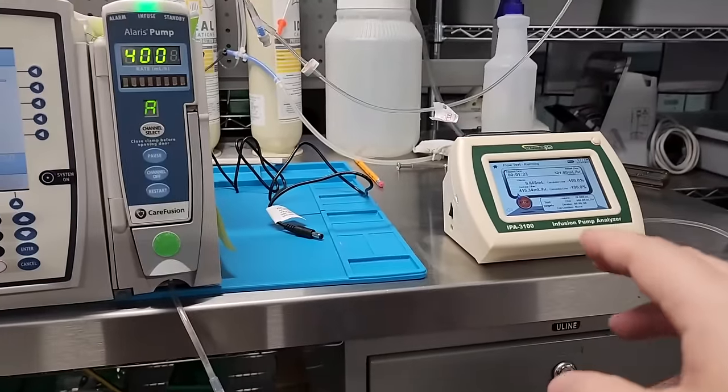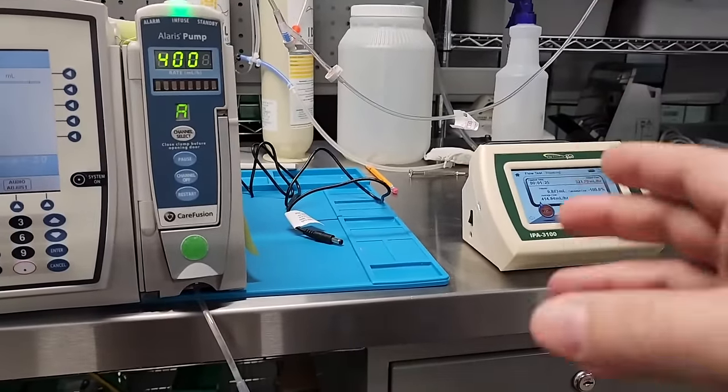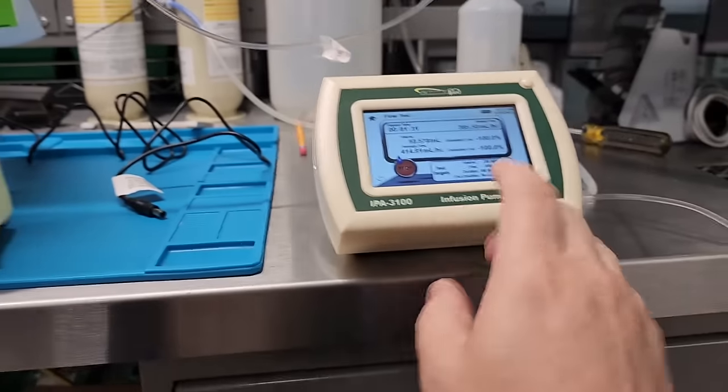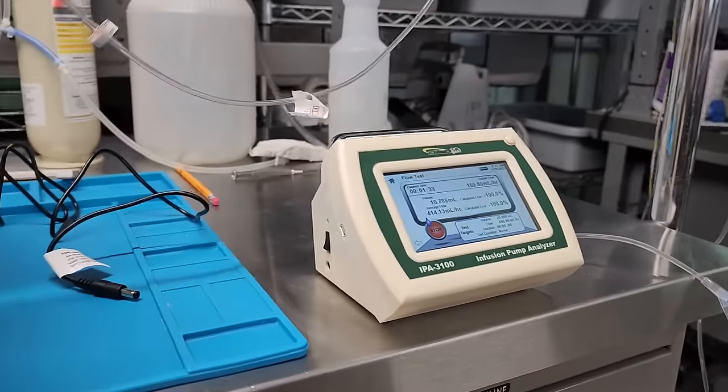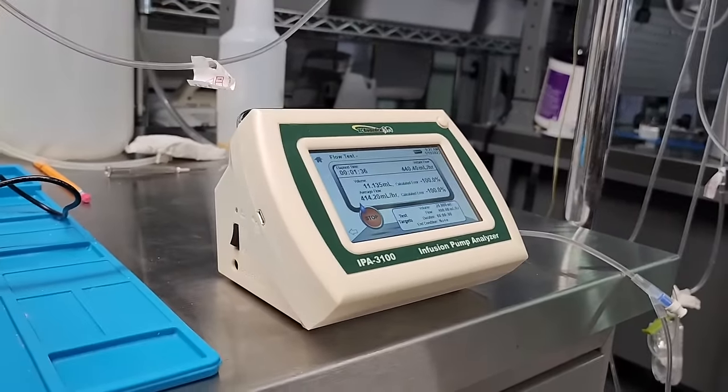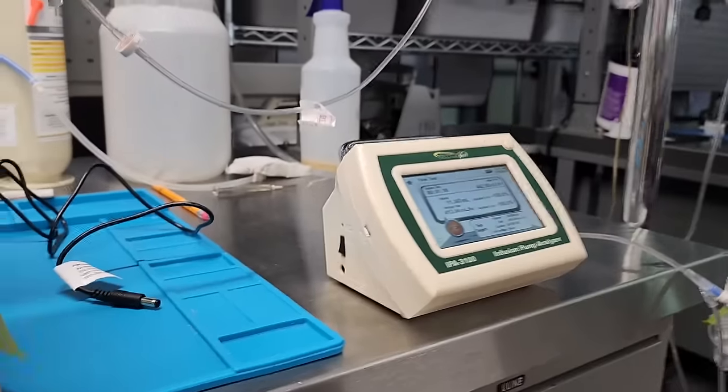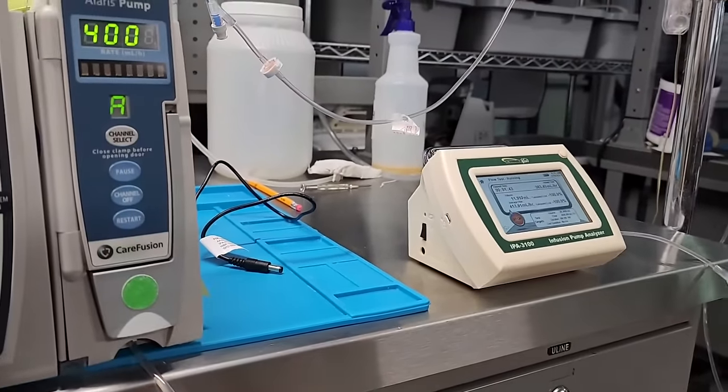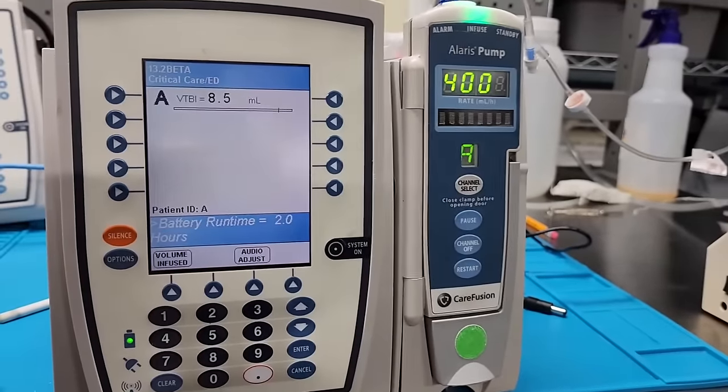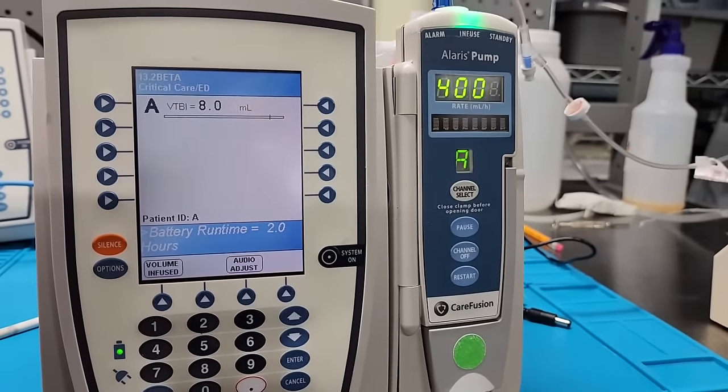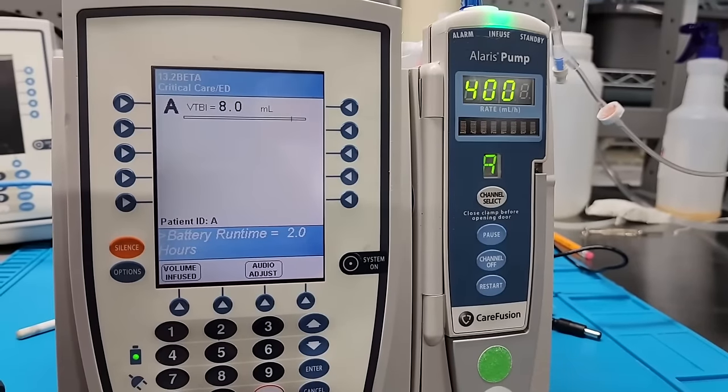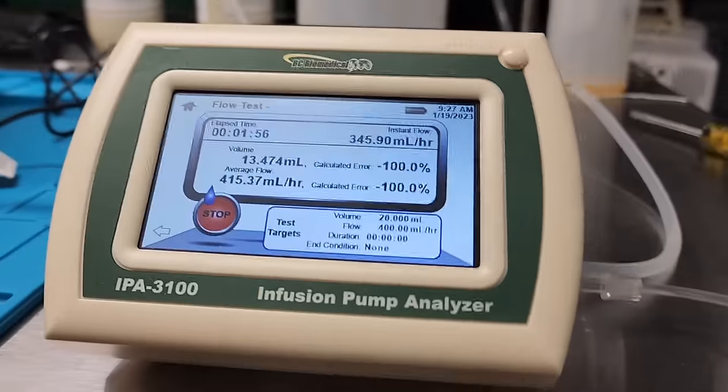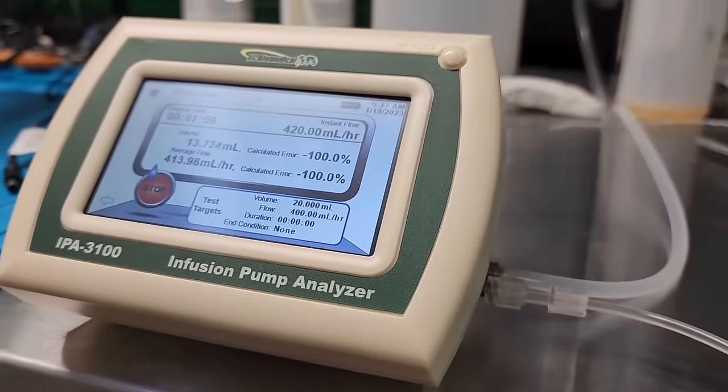So mind you guys, this is a prototype. There's things that could be changed between now and its release date. This guy is not on the market yet. I am thrilled that BC Group sought me out to do a video before it even hits the market. That way I can take a look at the operating system, its menu, see if there's anything that might need changing before it hits final production. Very cool. Let's see, we've got 7 milliliters left to go. At 400 milliliters per hour, this is actually a pretty quick test.